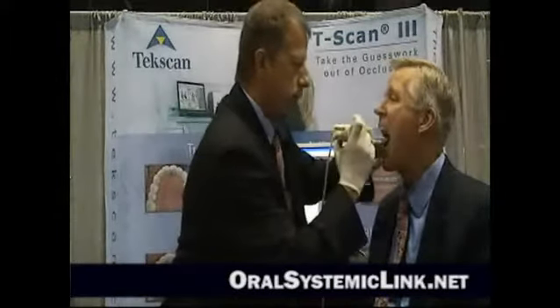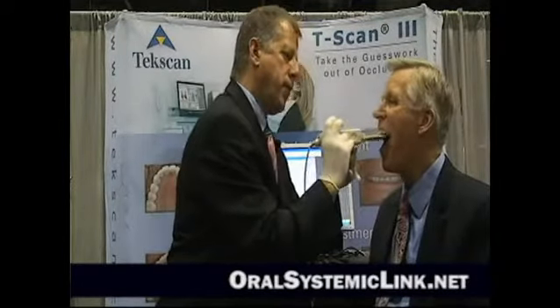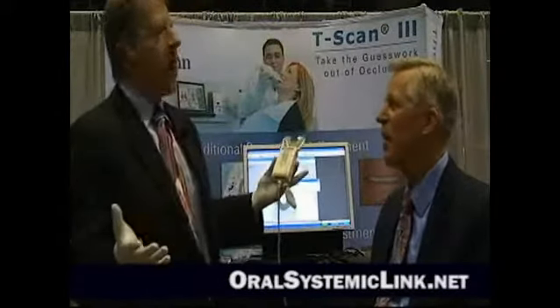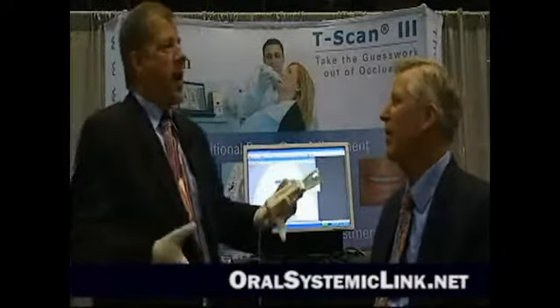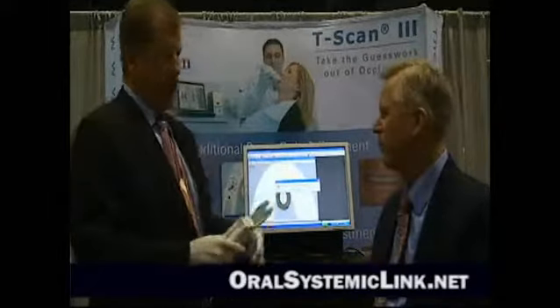Just insert it. When I tell you to, just bite down and close. Bite down. Open. Thank you. We can also do that in CR or something with bimanual manipulation if we wanted.